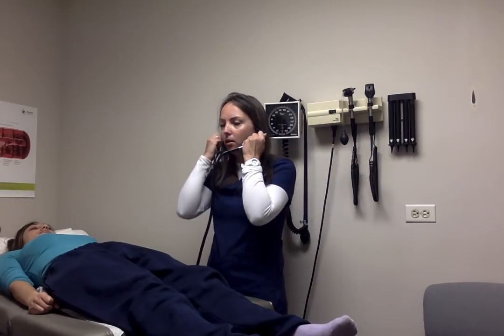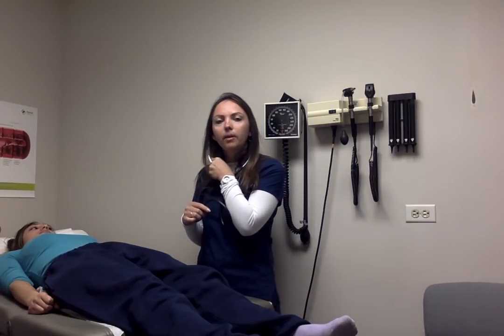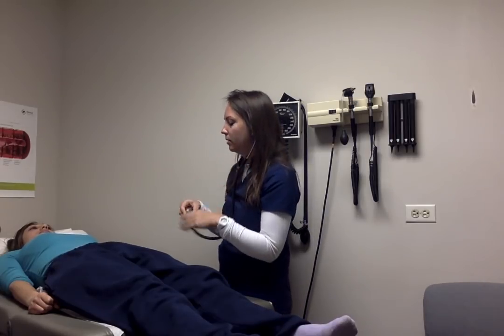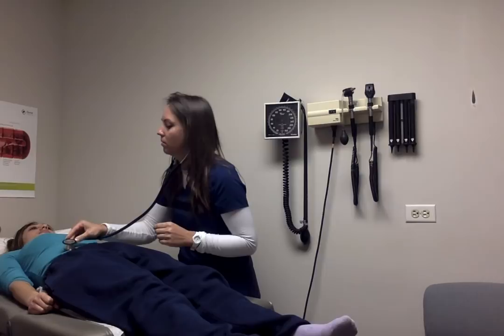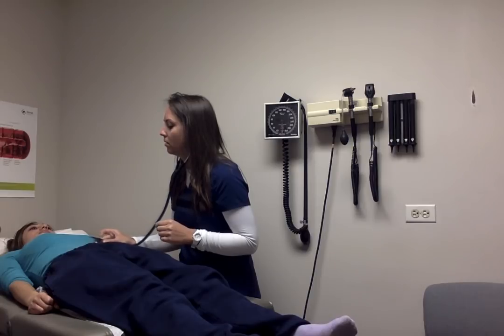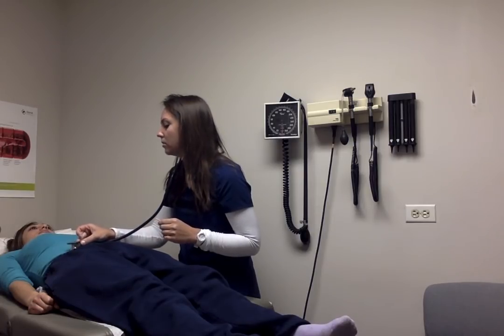Next, I'm going to listen to her bowel sounds. They're supposed to be between 5 to 15 per minute. If it's less than 5, hypoactive. If it's more than 15, it's hyperactive. I'm going to listen with my bell. I didn't hear any gurgling or any abnormal sounds.